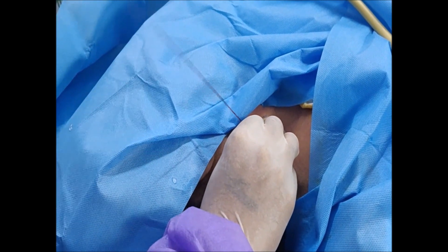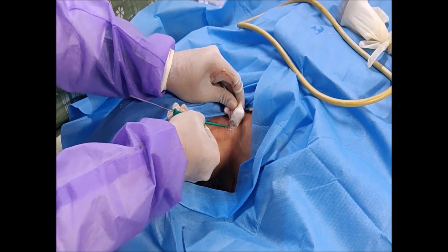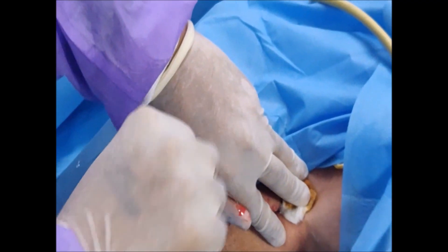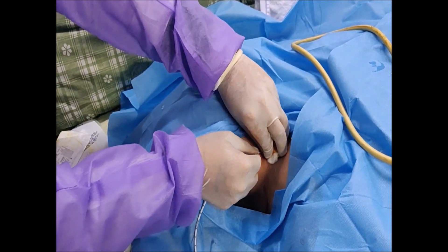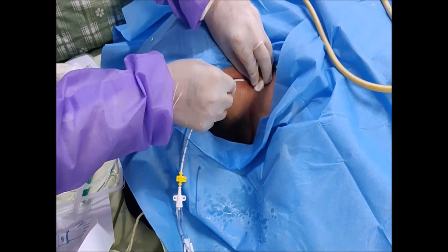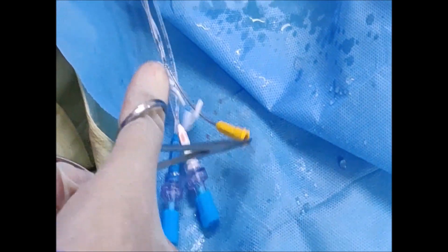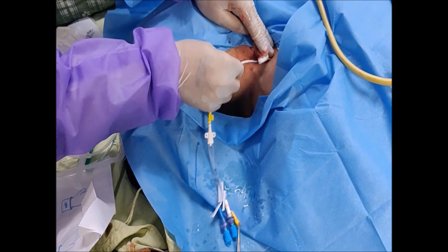Remove the needle while keeping the guide wire in position, then feed the dilator through the guide wire to dilate the track into the jugular vein for smooth insertion. Feed the catheter over the guide wire, maintaining control of the wire at all times. Before advancing the catheter through the skin, pull the wire slightly out until the external end extends outside the catheter hub. Use a needle holder or forceps to grasp the external end of the wire and carefully feed the catheter into the jugular vein.